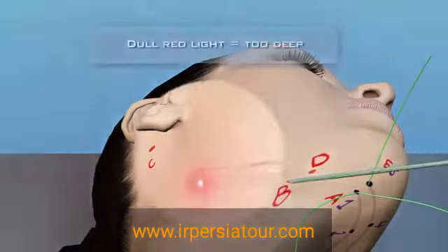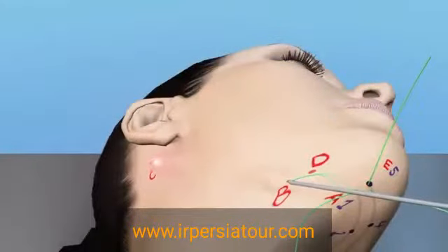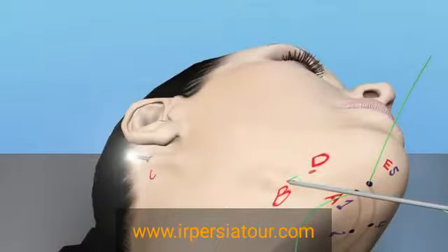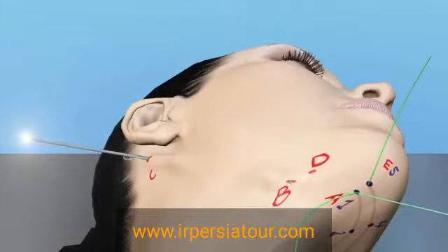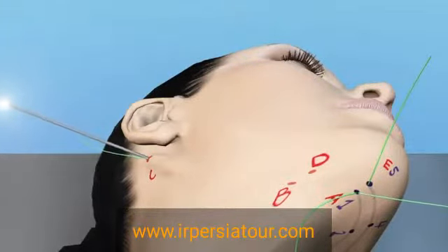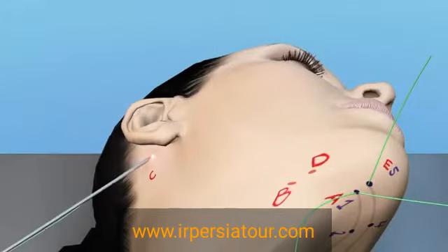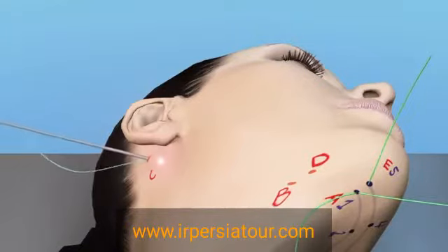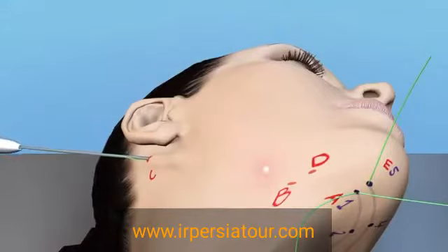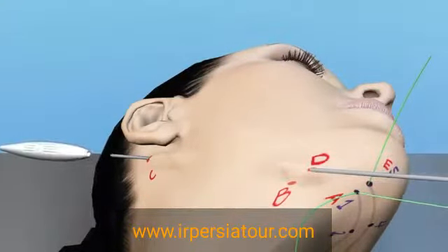Visualization of the bright yellow dot of light shows that the rod is in the correct plane. If the light becomes dull or red, the rod must be withdrawn and then redirected more superficially. If the rod passes too deeply underneath the platysma muscle, this may result in recurrent or residual platysmal banding and a less than ideal result. In the worst case scenario, the rod could create an injury to deeper structures in the neck.